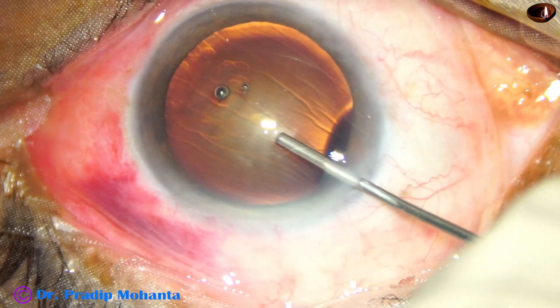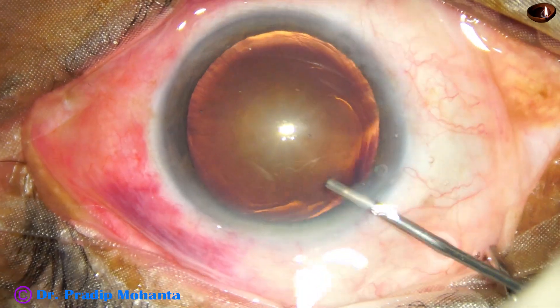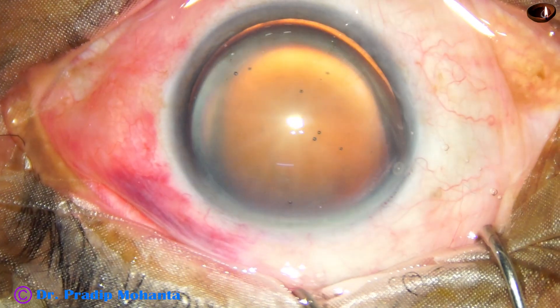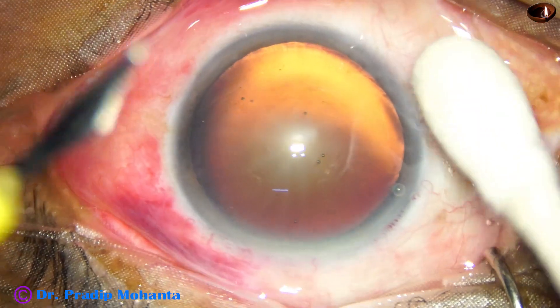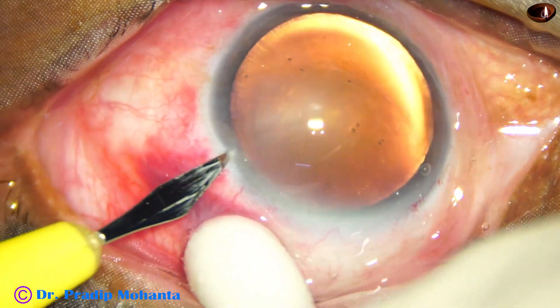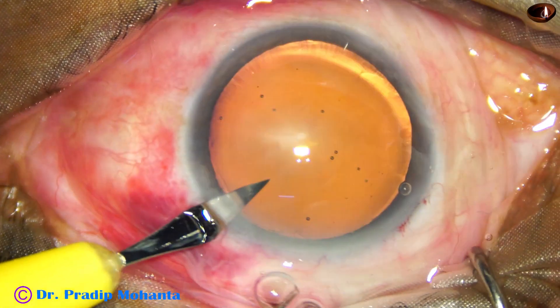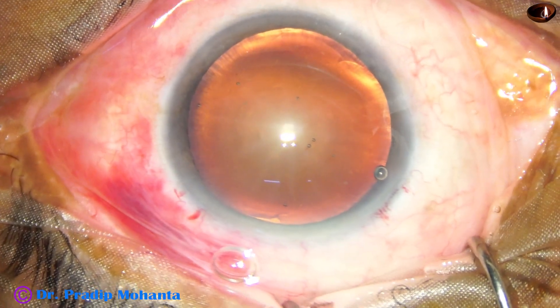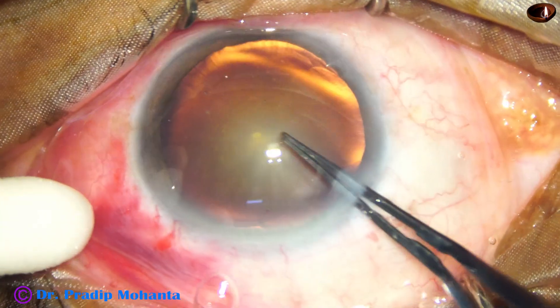The anterior chamber is filled up with 2% hydroxypropyl-methylcellulose, and methylcellulose is applied over the ocular surface for better visibility. A side port is made on the left side of the main wound, about 3 clock hours away.